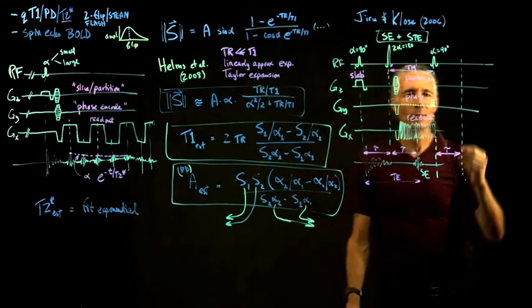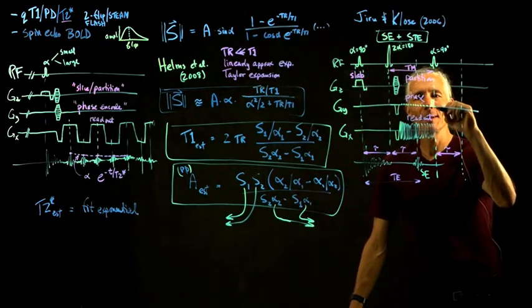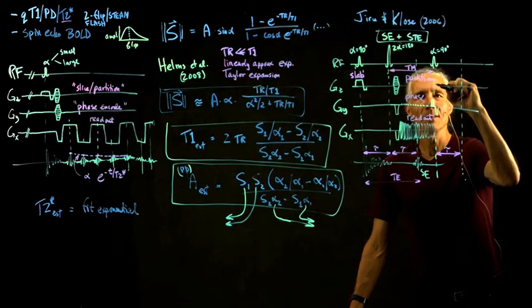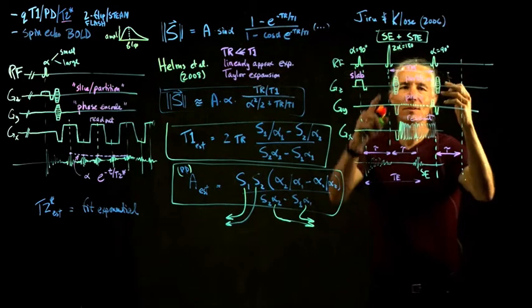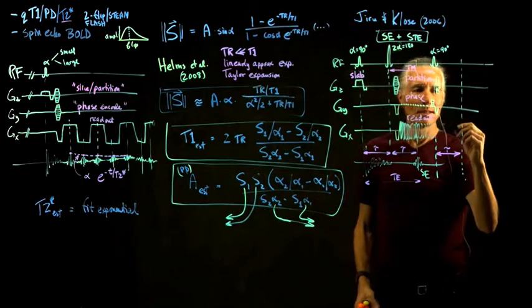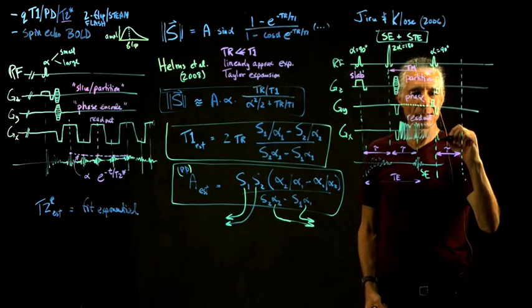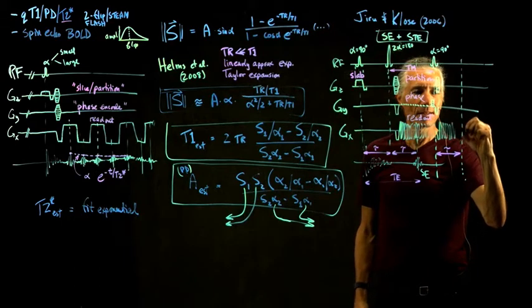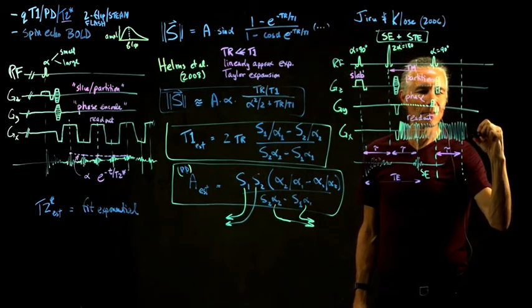So we have to arrange to collect that, and the way we arrange to collect that is we go to the corner of K-space again, and do some more partition encoding steps. So we have to do this whole mess that many times. And then go back to the corner of K-space, go back and forth, collect all that data again. So we have a second readout.